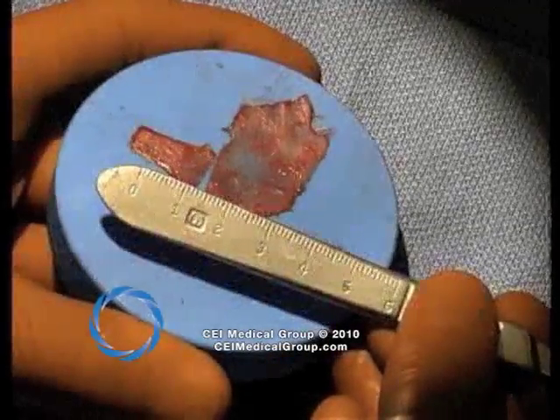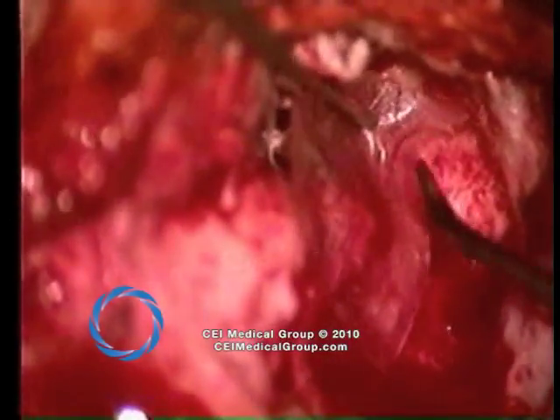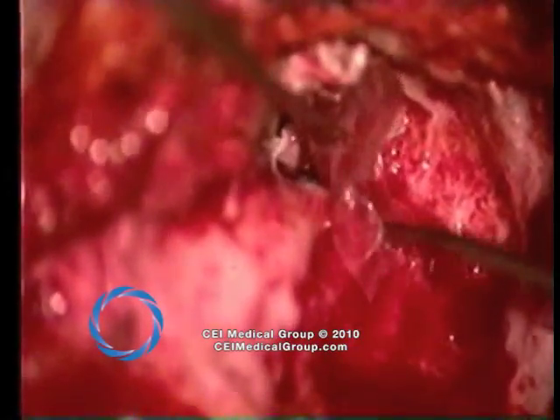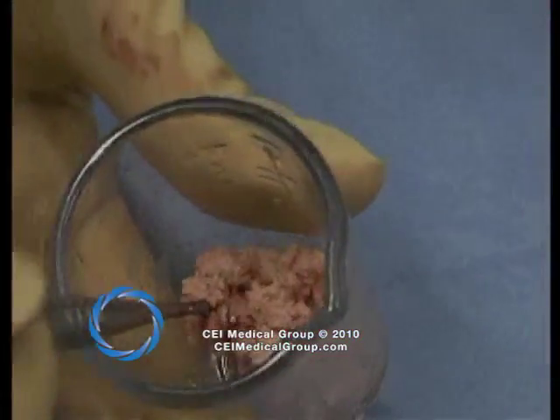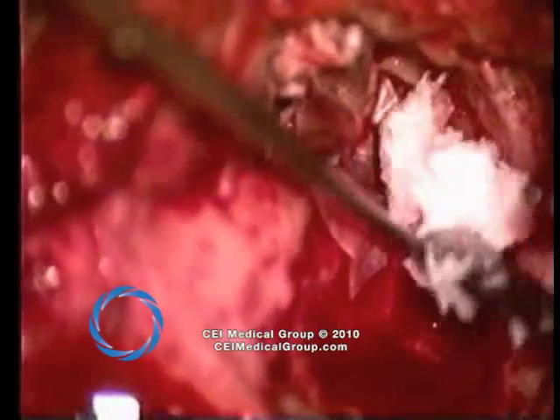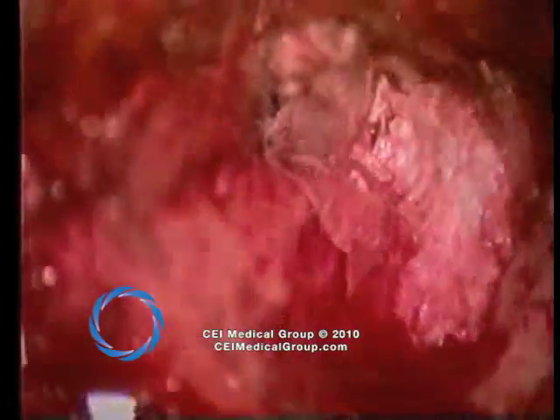The previously harvested fascia is cut into two pieces, the smaller of which is inserted with a small tail extending into the supratubal recess. You see the fascia being placed on the floor of the epitympanum, extending along the facial nerve, creating a space sequestered from the middle ear against the tegmen. The fascia is left inferiorly and bone pate is loaded on an elevator and handed to the surgeon to be positioned in the epitympanum. The bone pate is placed directly against the dural dehiscence and serves to reconstruct the area.